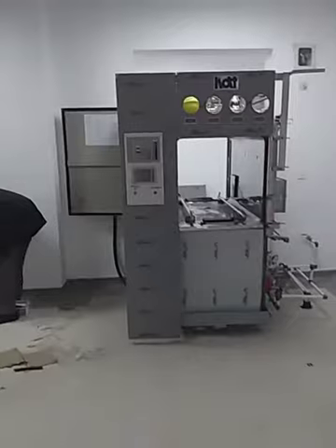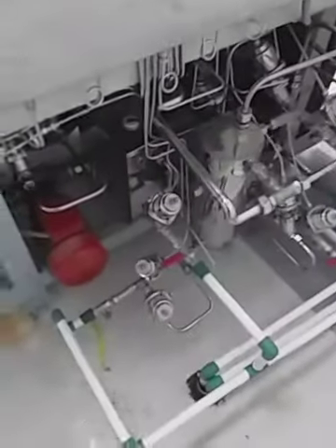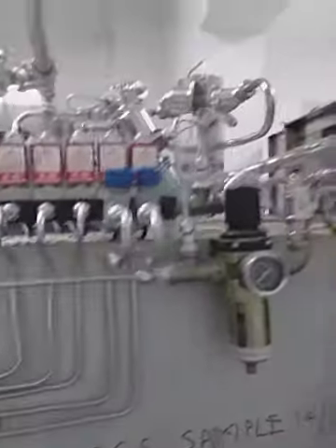First of all, I want to show you all the pipings which I have done so far. You can see all the pipings — all the pipings are done by me. I have installed each and everything.